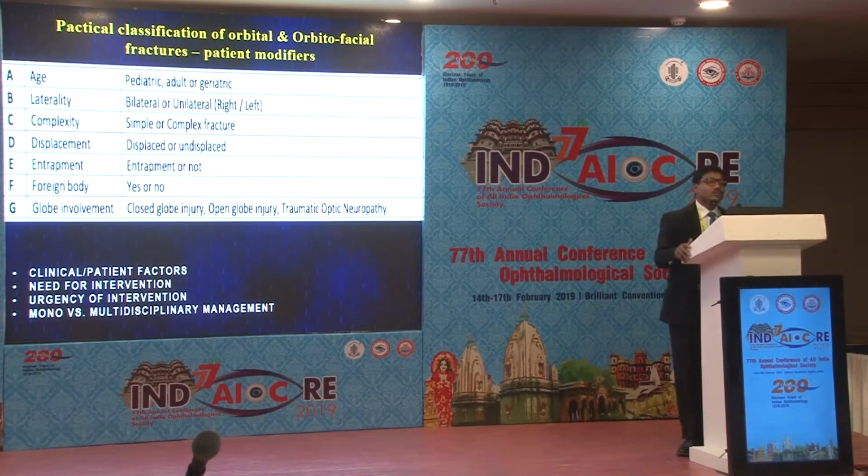And then we came up with patient modifiers because the classical classification does not tell you about threshold for intervention, timing of intervention, should you go in or not, what kind of implants you put in.